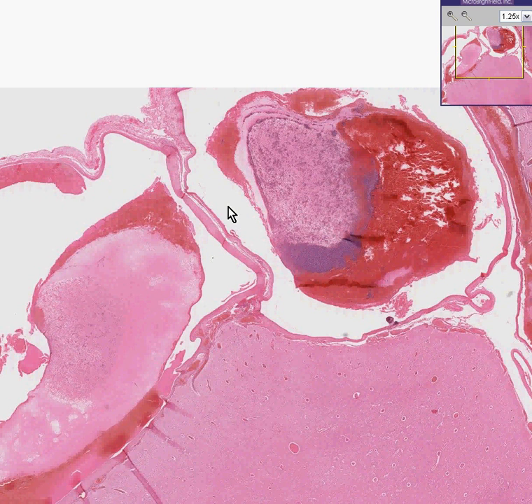capillaries, then we think about big lumen, small wall, low pressure veins. Well, in the process of developing, sometimes the process gets mixed up, and there are communications between arteries and veins. And now vascular spaces have to handle higher pressures, and the arteries sometimes make direct communications with them. And as a result, there could be hemorrhage in that area, there could be blood clot, and that's what you're seeing here. You're seeing blood clot, you're seeing hemorrhage, and this is an AVM.